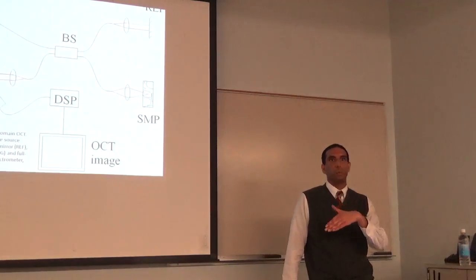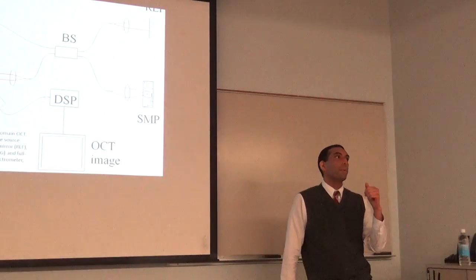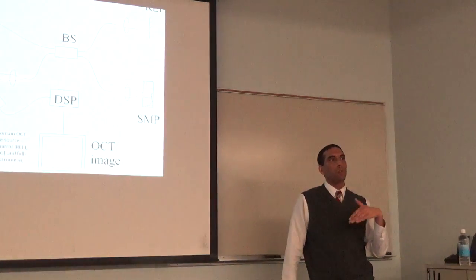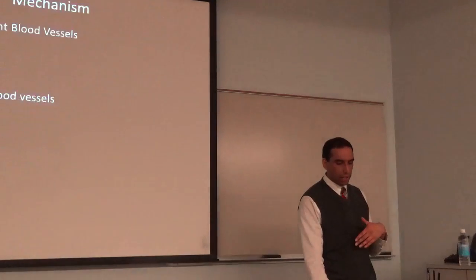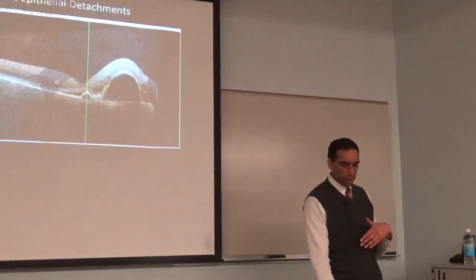What's the usefulness? Can we detect certain genetic retinal degenerations? The answer is yes, because the retinal degenerations will usually give you an atrophic change in the retina. So, for instance, I showed you that zonal retinopathy. Let me see if I can find it again.